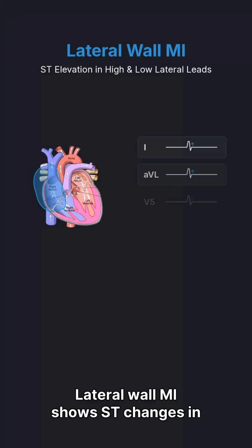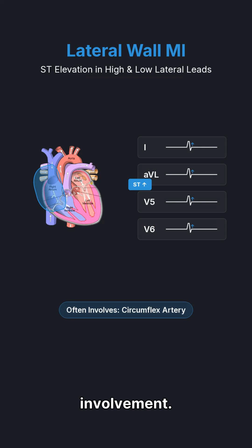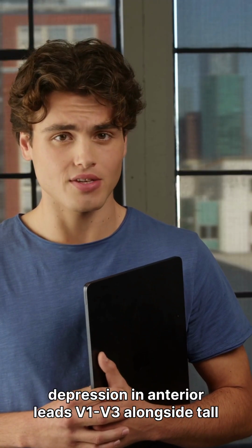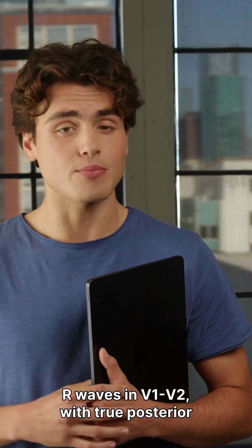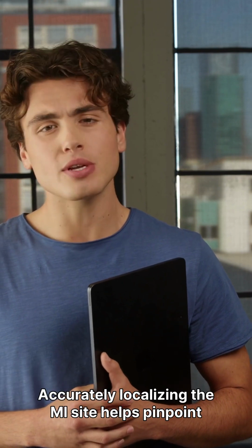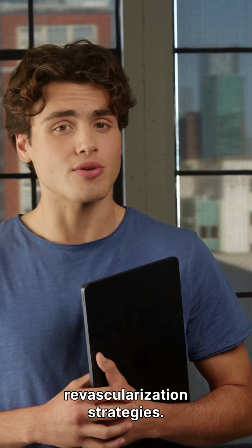Lateral wall MI shows ST changes in high lateral leads I, aVL, and low lateral V5, V6, often from circumflex artery involvement. Posterior MI is indirectly suggested by ST depression in anterior leads V1 to V3, alongside tall R waves in V1, V2, with true posterior leads confirming elevation. Accurately localizing the MI site helps pinpoint the culprit coronary artery and guides precise revascularization strategies.